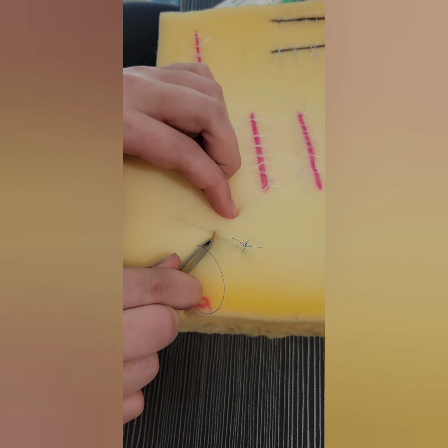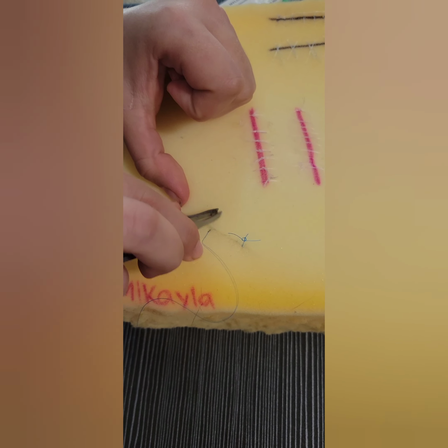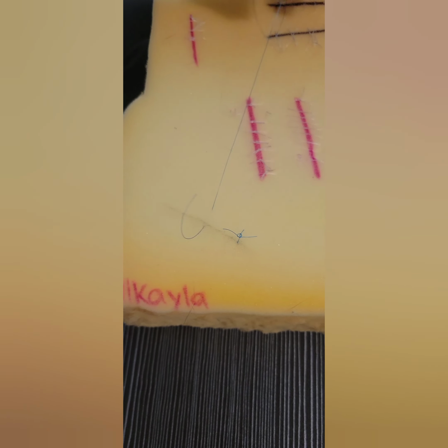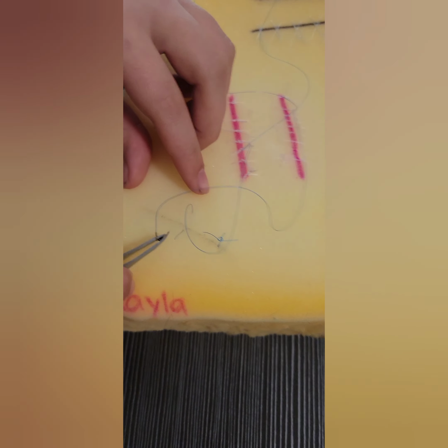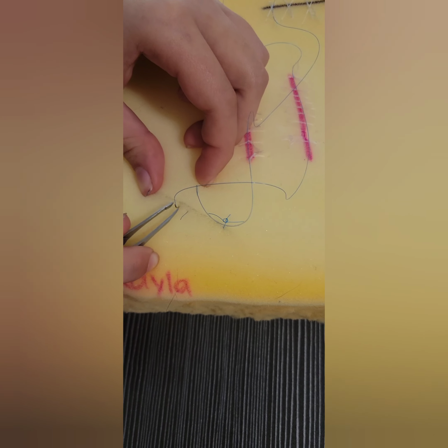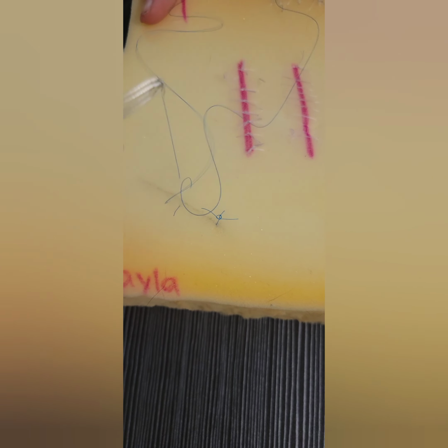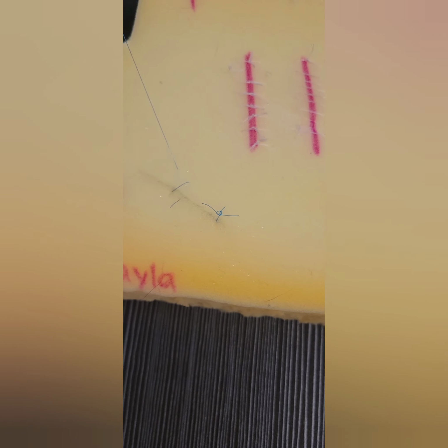Okay, the second stitch I'll be showing is the cruciate stitch, or the X stitch. You start from right to left, typically if you're right-handed, and then the opposite if you're left-handed. You go in from the right, and then you go in for the second enter point the same way that you just did. After you get it through the skin, you connect the first 2 points together by tying a knot. And typically you do 3 knots to secure it.